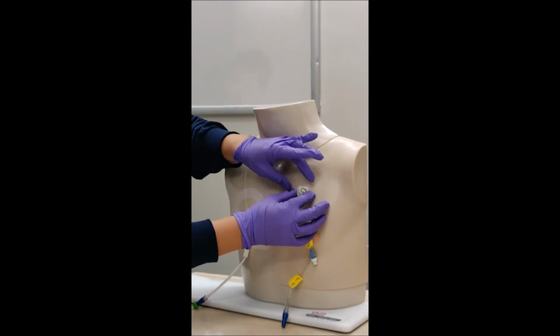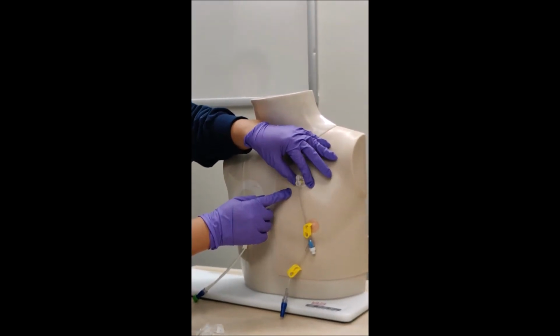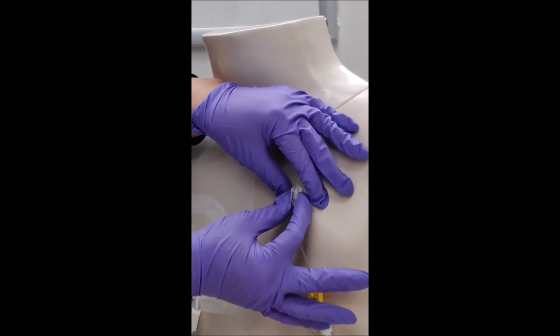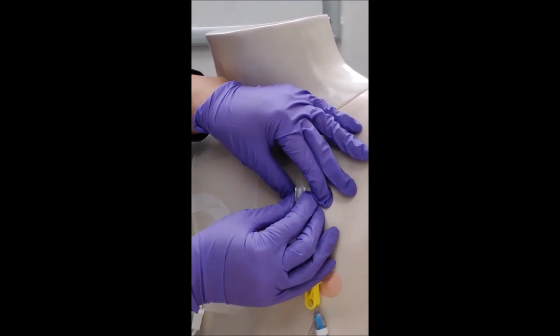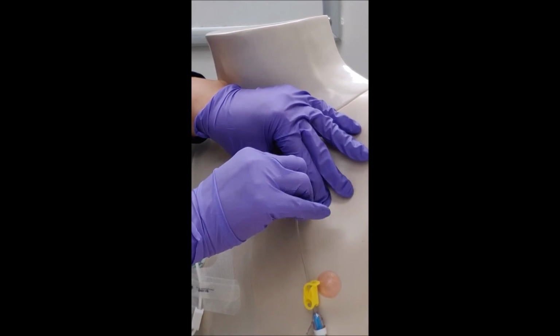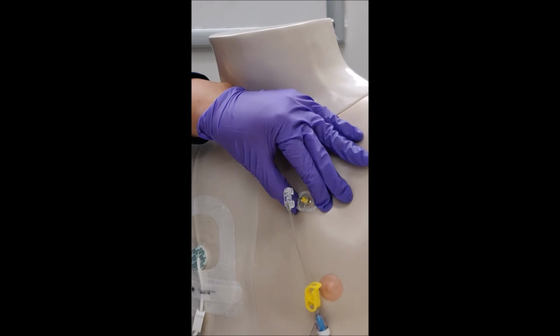So to deaccess, I'm going to use my non-dominant hand. I'm going to use my finger and my thumb to hold the bottom. And then this part over here, I'm actually going to pull up, and it's going to lock. Okay, here we go. 1, 2, and 3. Up, we pull.